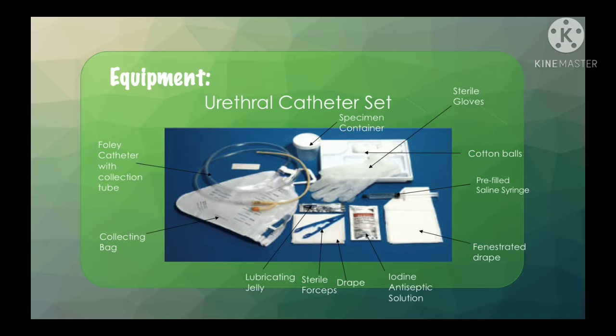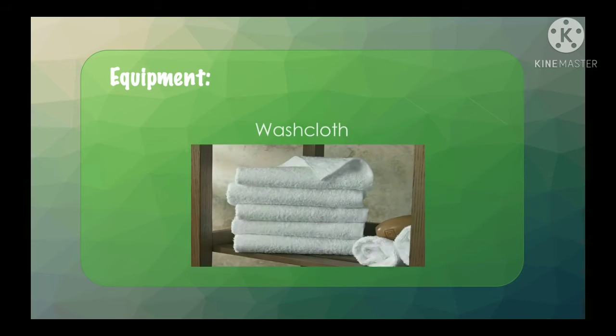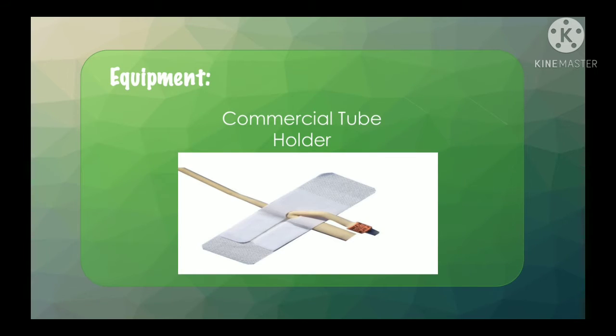Next is basin of warm water, washcloth, tape, non-sterile gloves, commercial tube holder, bedpan.